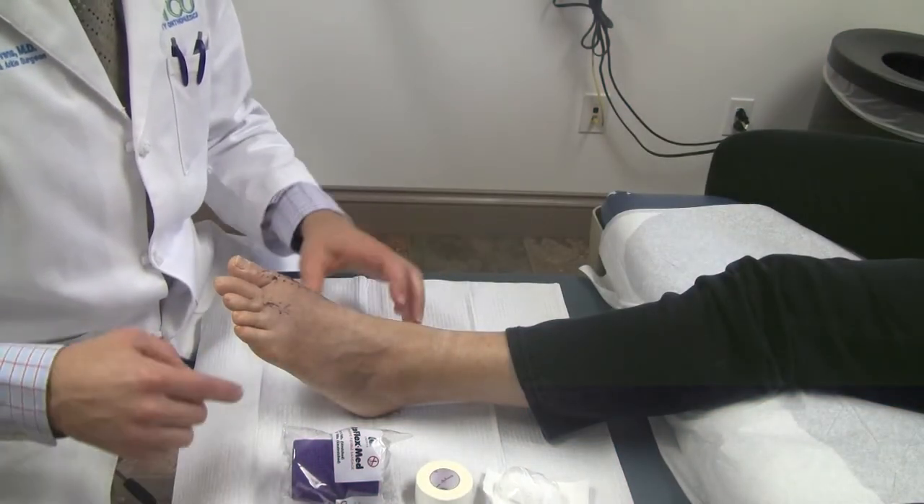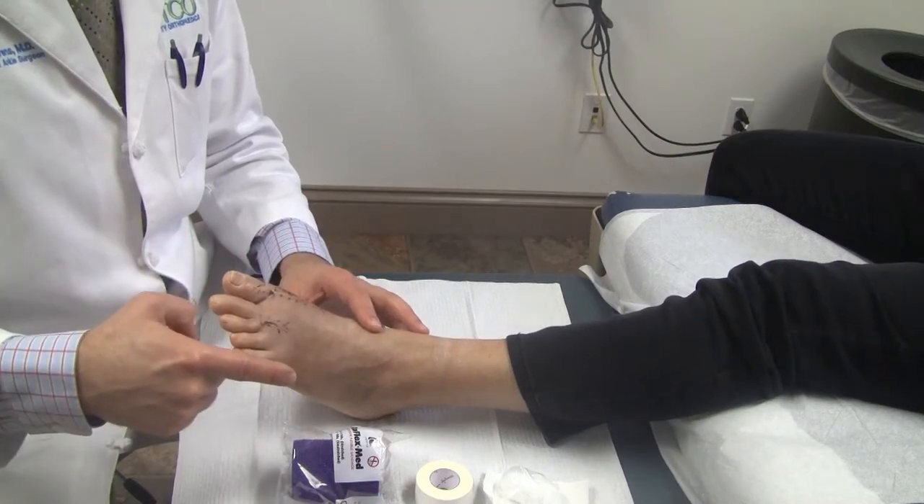Hi, this is Dr. Stevens here. I'm explaining how to do the tape and gauze dressing for a big toe fusion.